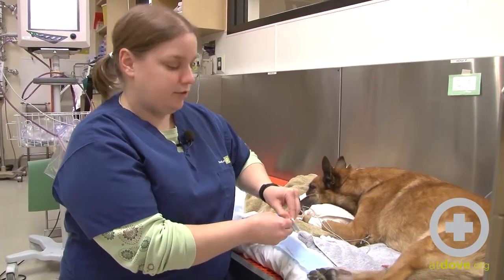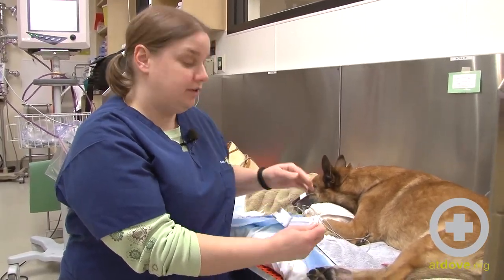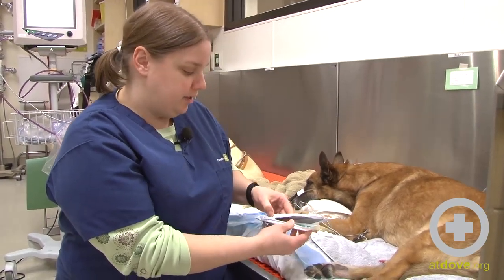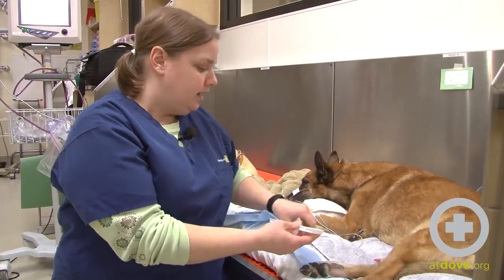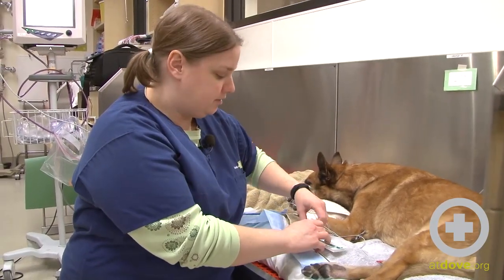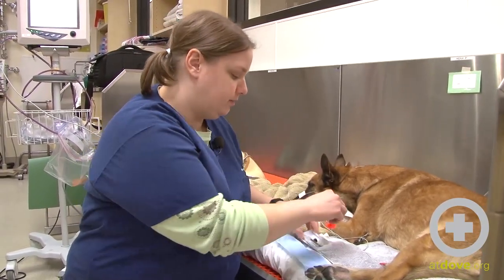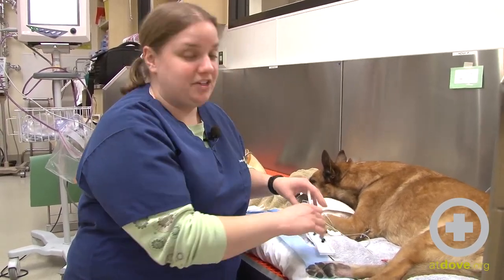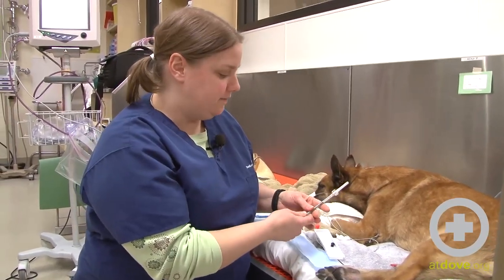Hi, I'm Megan. Today we're going to perform an arterial stick to get an arterial blood gas on this dog. He has aspiration pneumonia, and we are getting some pretty poor readings on our pulse ox, so an arterial blood gas is a really good way to get an accurate understanding of what's actually happening inside his vessels.